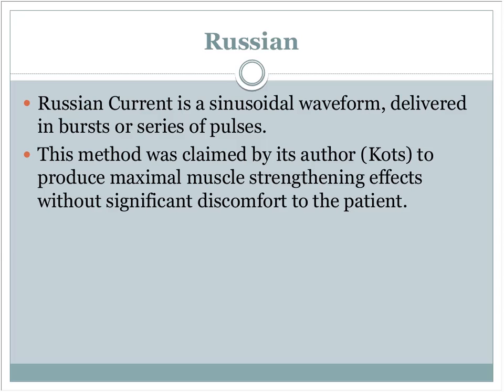Russian stim, which I always think is slightly amusing because I believe it gets its name not only from the original designer or the guy who talked a lot about it, Kots, but also because the Russians tried to use electrostimulation to enhance the performance of their athletes in the Olympics back in the 70s, by having the muscle contraction from the machine come on when they're exercising, trying to actually make their athletes stronger, and it didn't work.